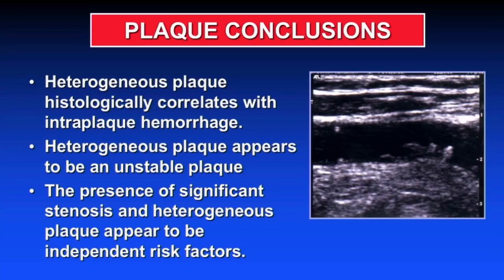A homogeneous plaque is the stable form of plaque. And if it's the high degree of stenosis, it could be treated differently. Right? More logically, those will be done with angioplasty and stent because you don't have the risk of the plaque breaking down and distally embolizing. If you have a patient with the same degree of stenosis and it's heterogeneous plaque, I really would urge you to tell the vascular surgeons to operate on this one, not the cardiologist to do an angioplasty and stent. And I think you will positively influence that patient.